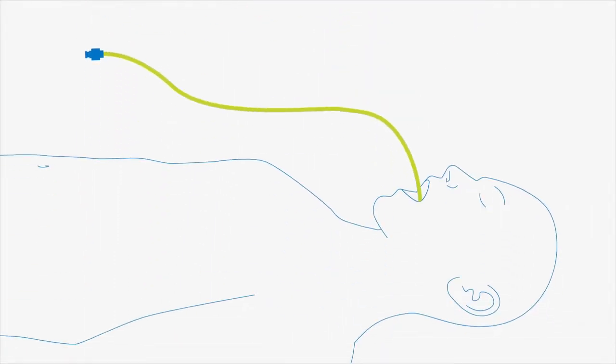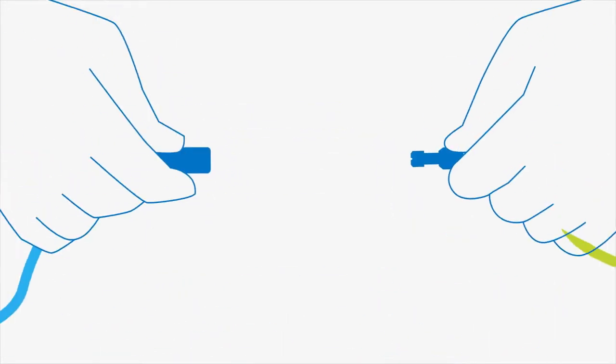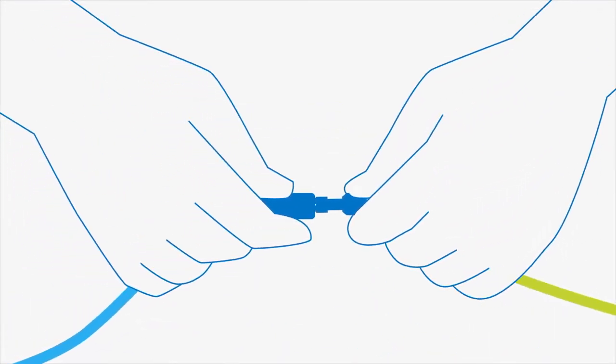Place the temperature probes one of three ways: esophageal, rectal, or Foley. Connect the primary temperature probe to the adapter cable.